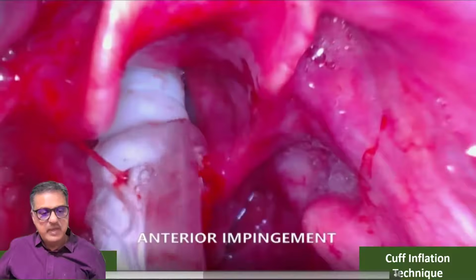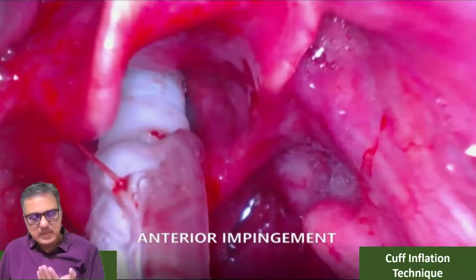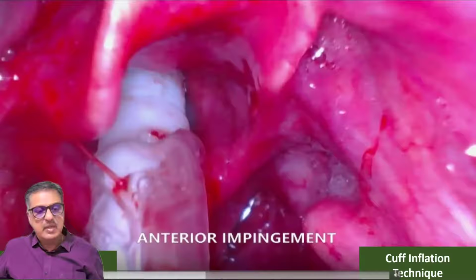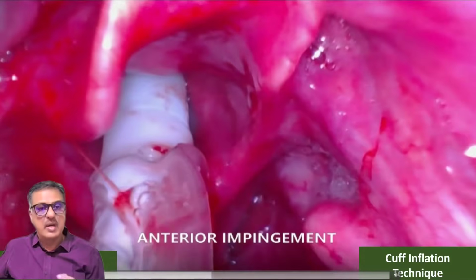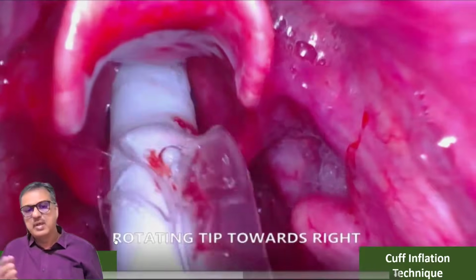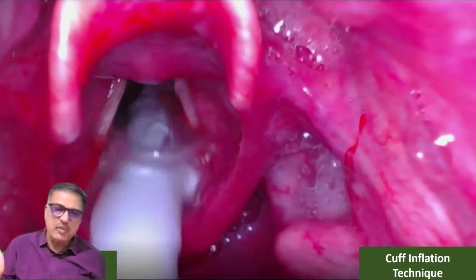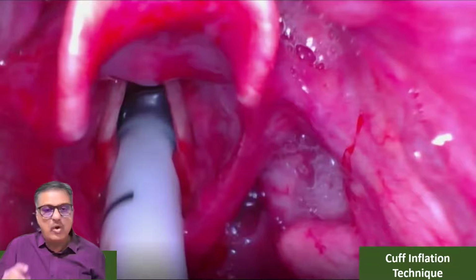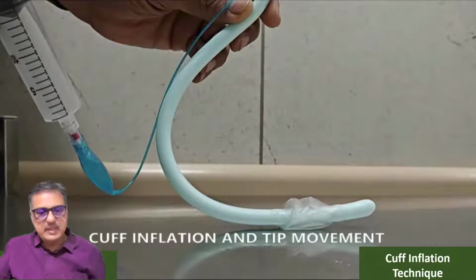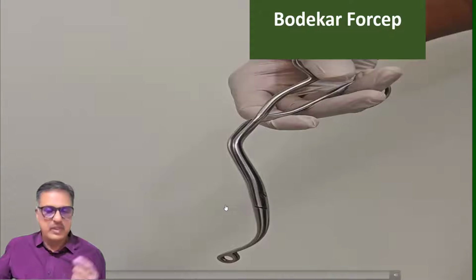Now what happens? Many times, once you deflate the cuff, because of the tube trajectory towards the anterior part of the larynx, it hits the anterior tracheal or anterior laryngeal wall. You are not able to negotiate the tube further. In such a case, rotating the tube to the right side will overcome this impingement, or make a slight flexion of the C-spine, or give external laryngeal manipulation. By these three techniques, you will be able to overcome the anterior impingement of the nasotracheal tube.